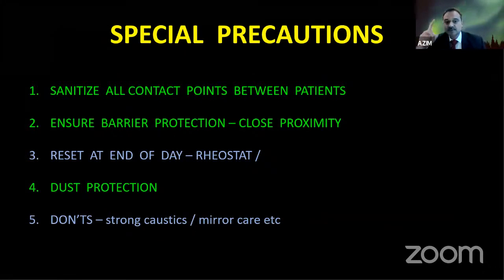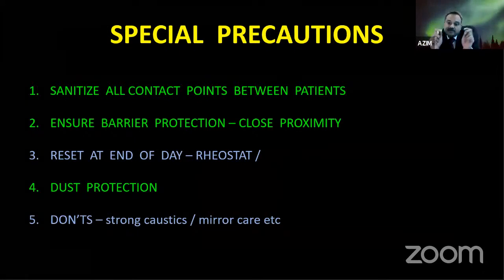And always remember, this machine will be used by different people. When you sit, organize it and set it for yourself before you begin. It's like when you get into your friend's car: you adjust your seat first. You don't just sit there and drive it, right? You set and adjust your seat first before you drive. That's exactly what you should do.